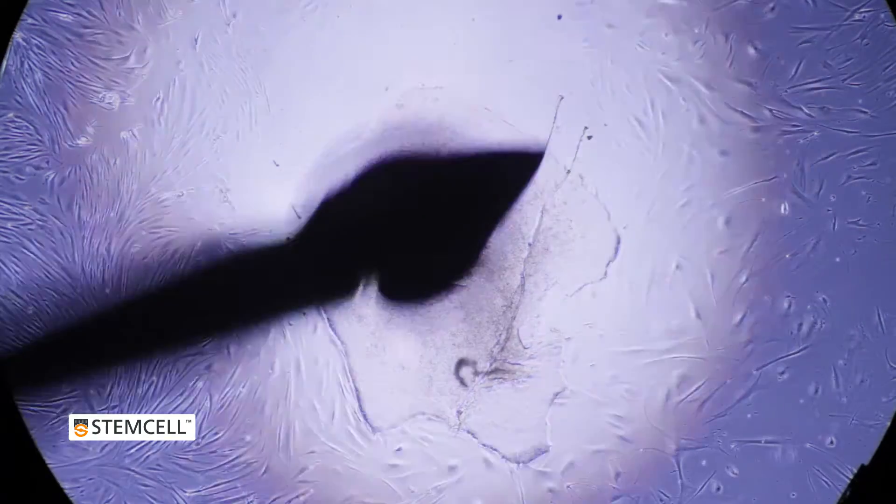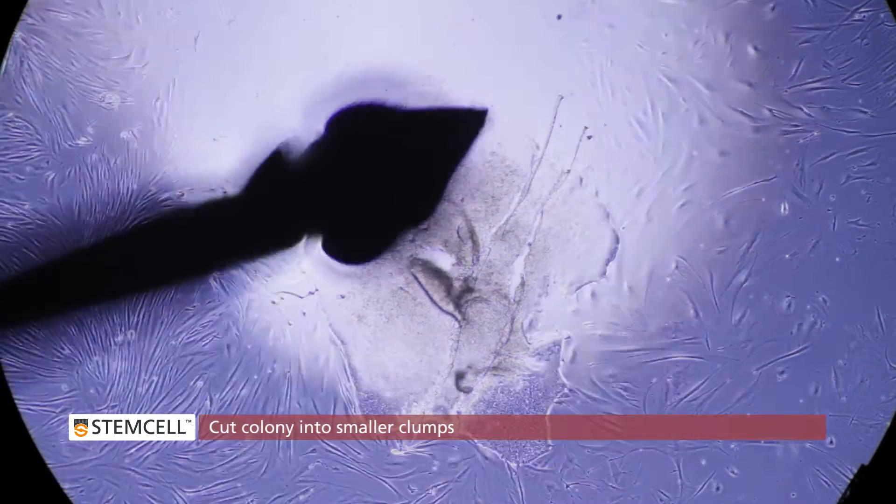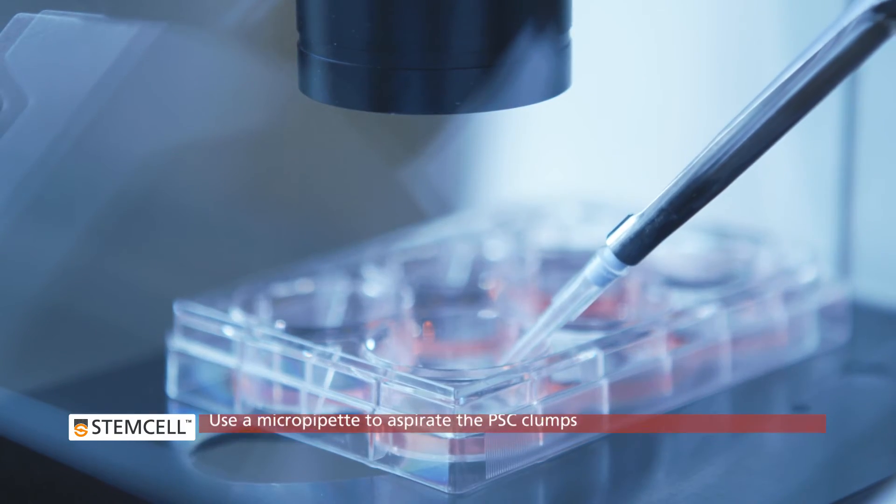Using the needle or pulled glass pipette, cut the colony into smaller clumps and aspirate the PSC clumps using a micropipette.